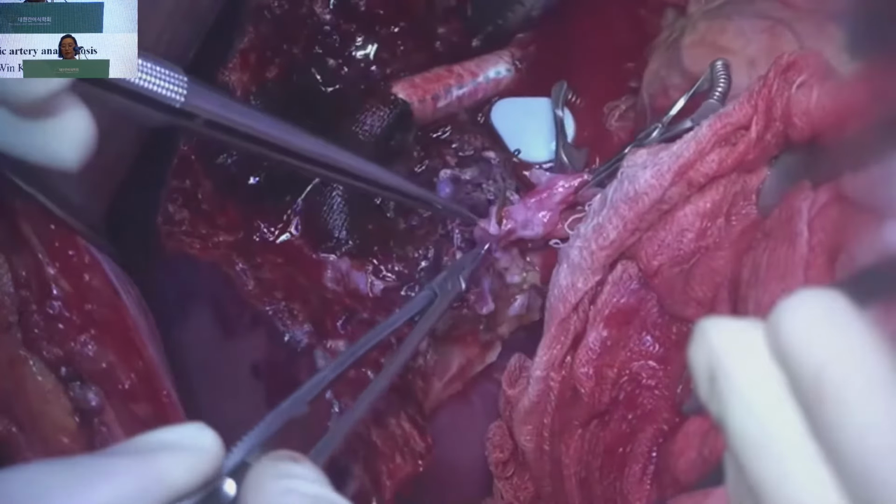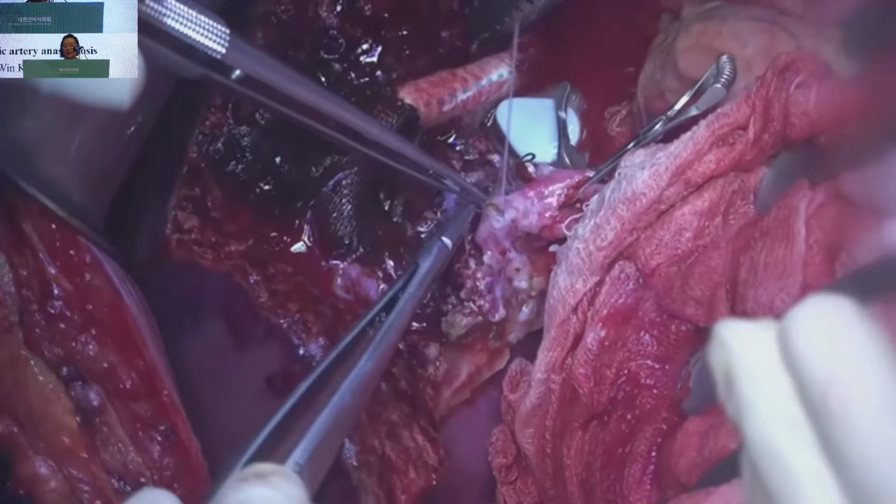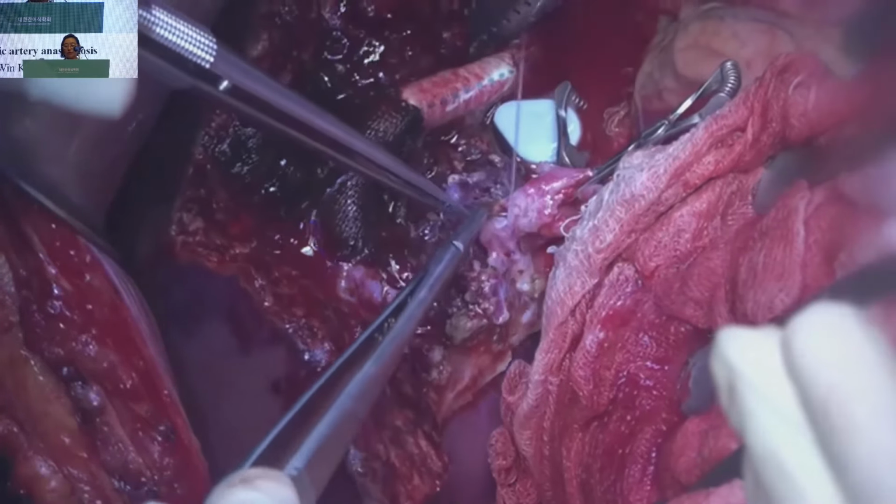Now I am finishing the anterior part of the anastomosis. Just pull the shunt.